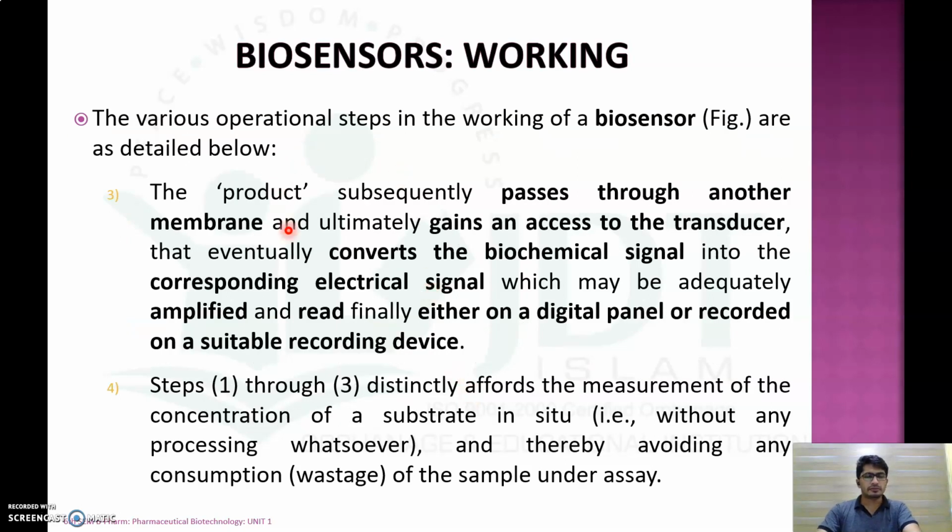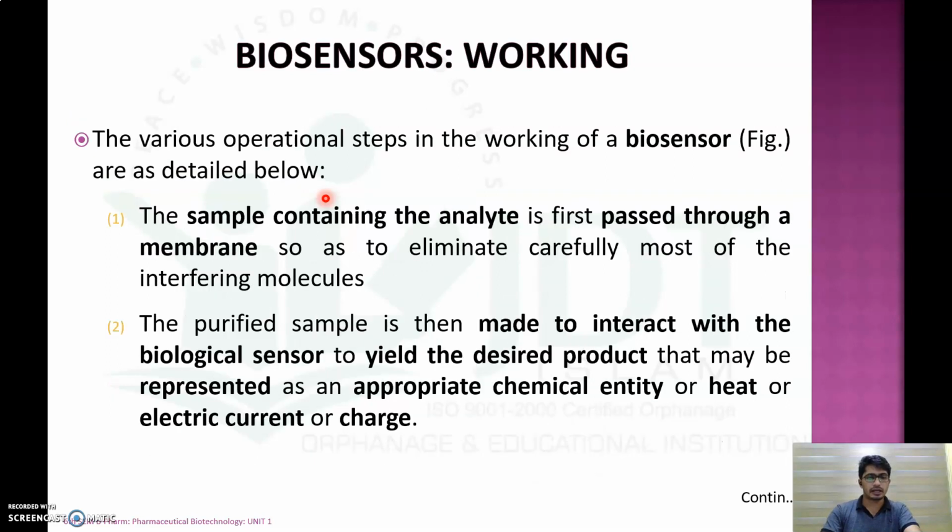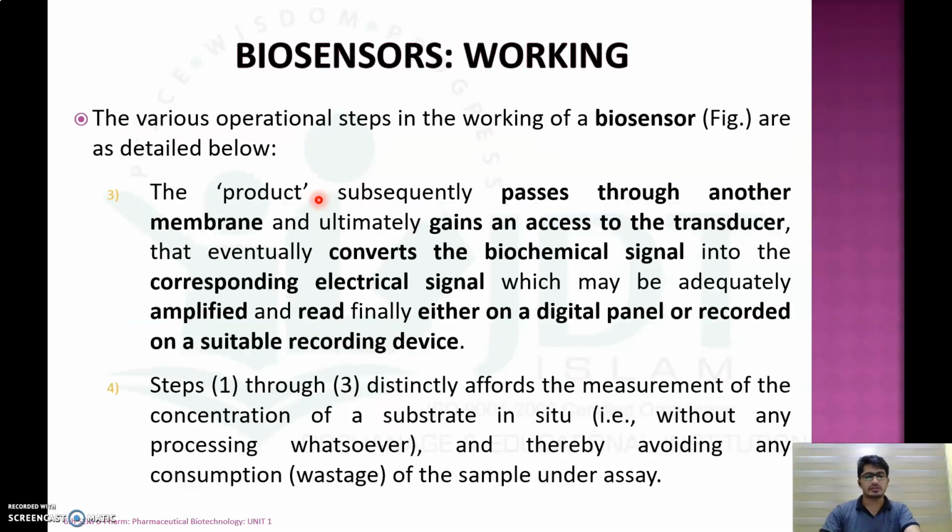Now, the product formed by combining the analyte with the biological sensor subsequently passes through another membrane, or inner membrane, which will ultimately gain access to the transducer that eventually converts the biochemical signal into a corresponding electrical signal, which may be adequately amplified, read, and finally either shown on a digital panel or recorded on suitable recording devices.